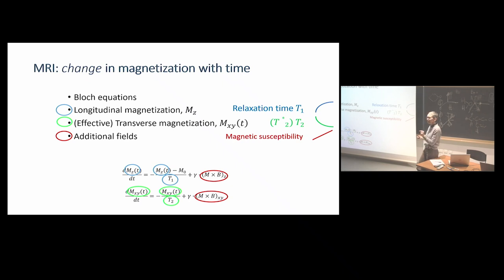The little additional change in Larmor frequency, in the order of 0.2 ppm or something like that, actually changes the Larmor frequency. So we have a little bit of change in the B field, and we can investigate that as well. And you see here, this is a linear evolution in time. So we have these exponential evolutions in time and linear evolutions in time that we can look at using MRI.